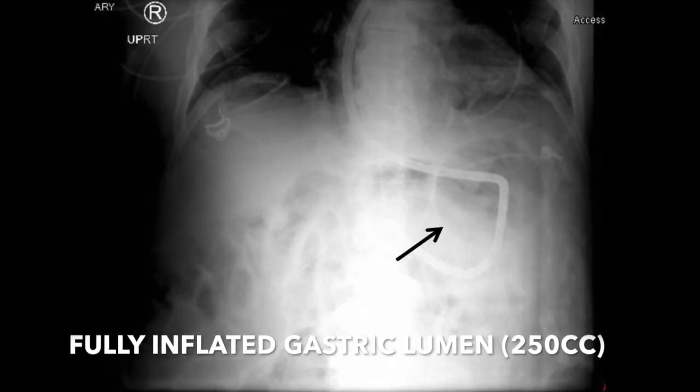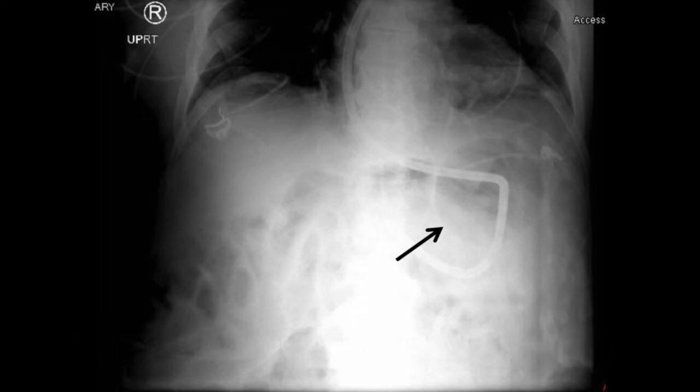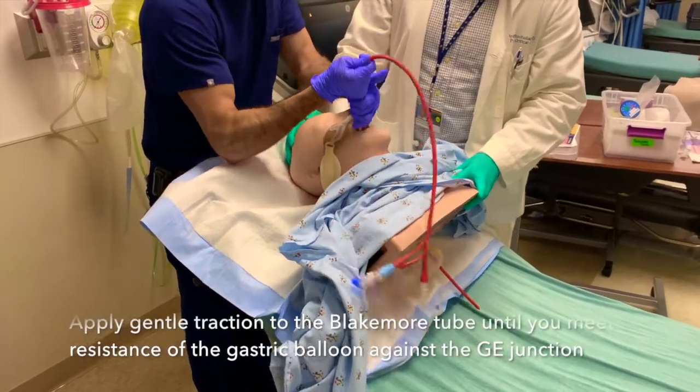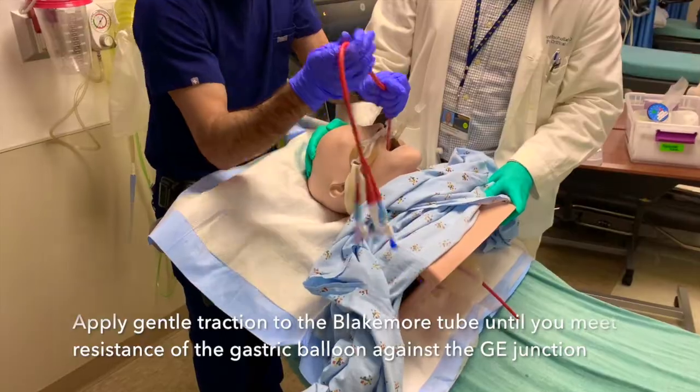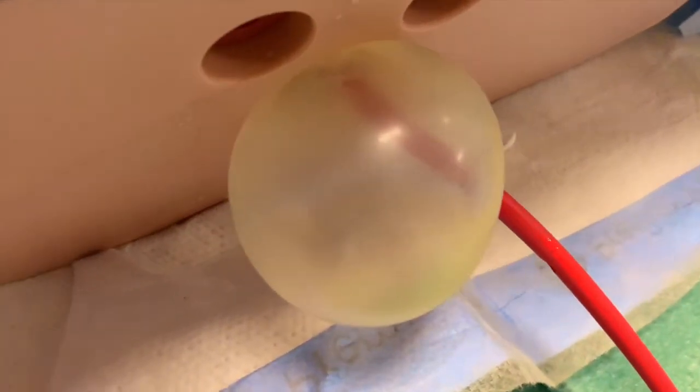Ensure to turn the stopcock off towards the patient after injecting the air. Take another abdominal x-ray. This is what it will look like after injecting a total of 250cc of air into the gastric balloon. Next, apply stable traction to the Blakemore tube until you meet resistance, which is where the gastric balloon is resting against the gastroesophageal junction. This is demonstrated here against the mannequin.